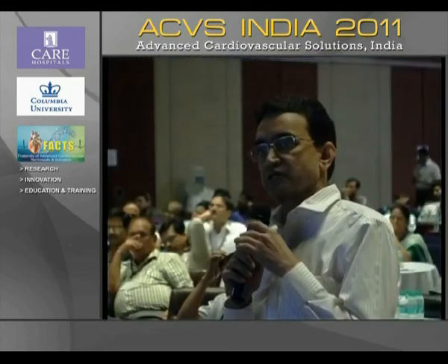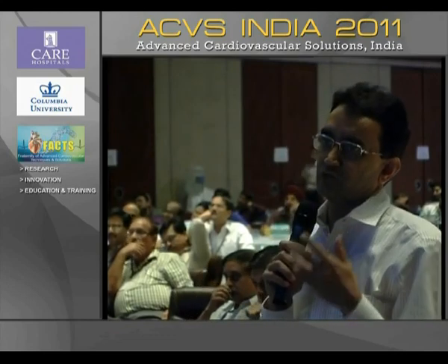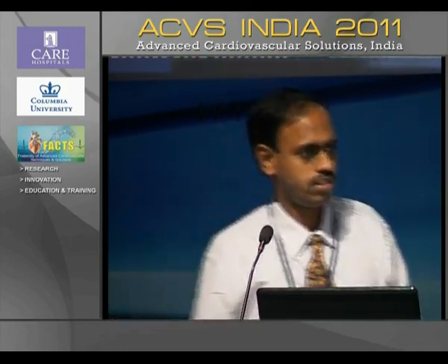Say, if you use this technique, in how many cases would you declare it a failure? Do you have such situations? The times at which I have failed with a balloon-assisted technique have been only with the 44 and 46 millimeter very large devices, in patients with defects measuring almost 40 or 41. Not in the regular range, up to 40, it is consistently reproducible. With 40 or 42 devices, it's consistently reproducible. It's a very good technique. I'm reinforcing it because the number of failures will be substantially lower if you use this. Thank you, Shiva. I think that has been a very lucid discussion.